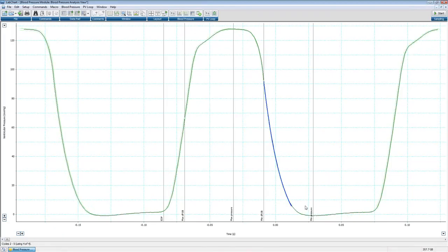And it's probably very tough to see right now, but there's actually 4 green lines that, of course, roughly parallel this line. And those are the four cycles that we're averaging across. You can see end-diastolic pressure being marked here, max dPdt, max pressure, min dPdt. The blue line right here is tau, and of course min pressure that's reached during the cycle, or the average min pressure for those 4 cycles.